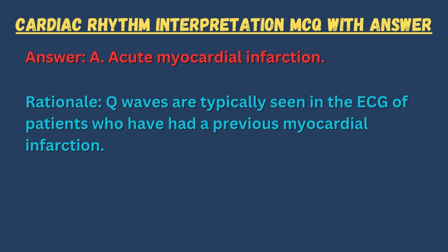Answer. A. Acute myocardial infarction. Rationale. Q waves are typically seen in the ECG of patients who have had a previous myocardial infarction.